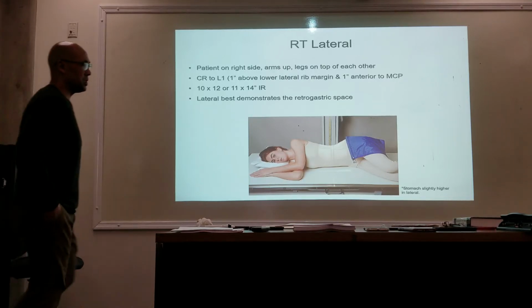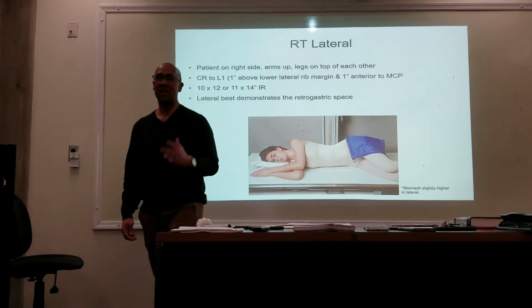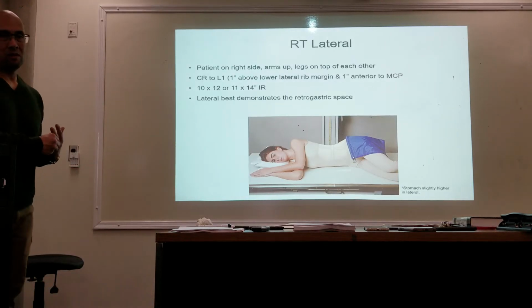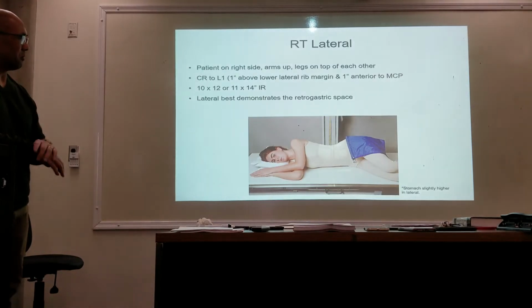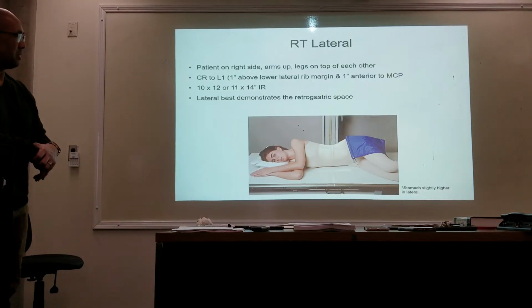Now, this is also good to note, is that the stomach does move slightly higher on a lateral. So use that as your guide, but you may want to move up just a little bit more from your starting point. Okay, so the stomach is slightly higher in the lateral.